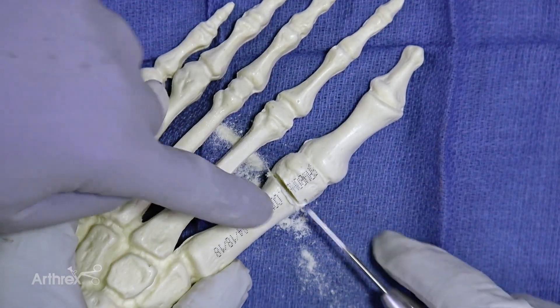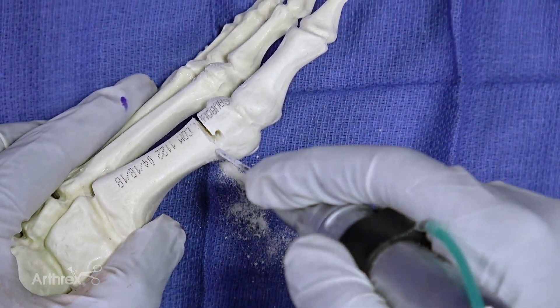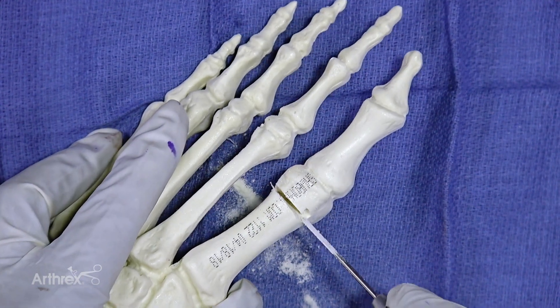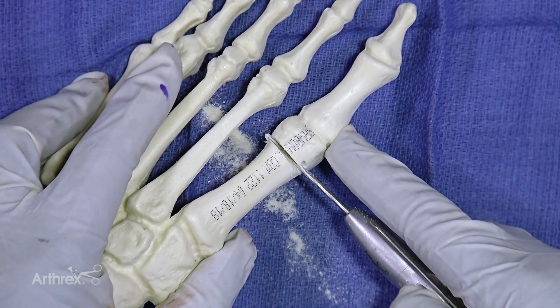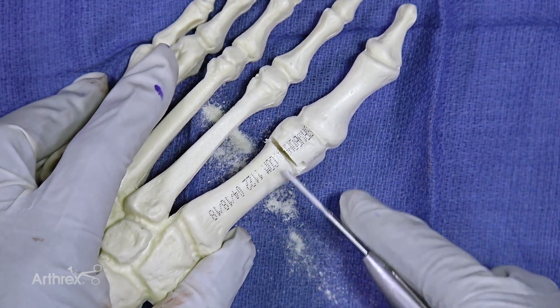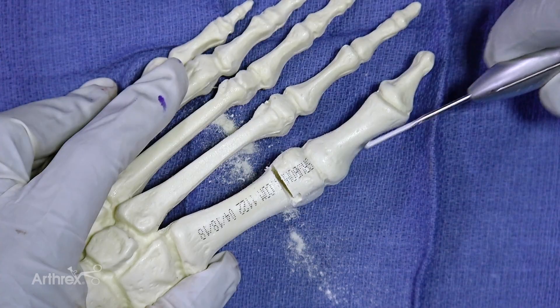The plantar limb is going to be more horizontal — more parallel to the weight-bearing surface of the foot. It's not going to be completely parallel, but it's going to be basically a shallow chevron in this direction. In order to affect that cut, we're going to put the burr back in all the way across — you can use fluoroscopy or we're looking at it directly in the sawbones. Instead of translating the burr, we're actually going to rotate our hand such that when we're done, our burr is almost parallel with the big toe.